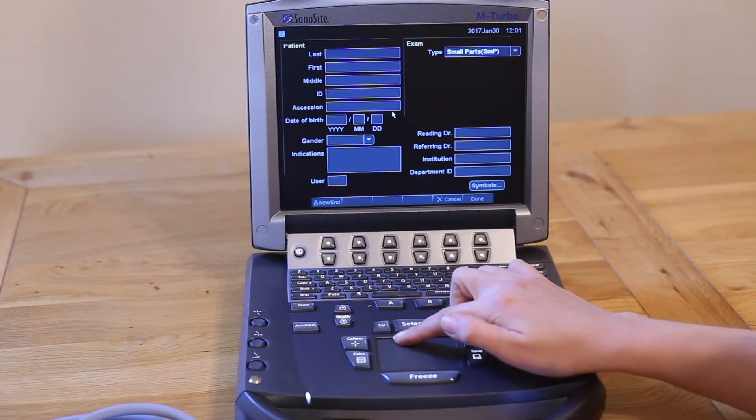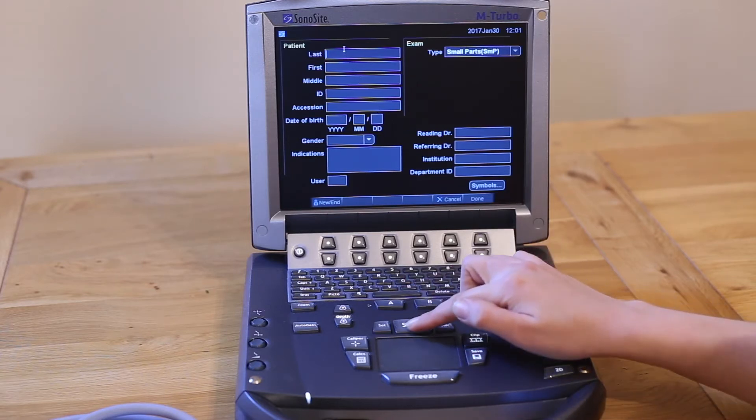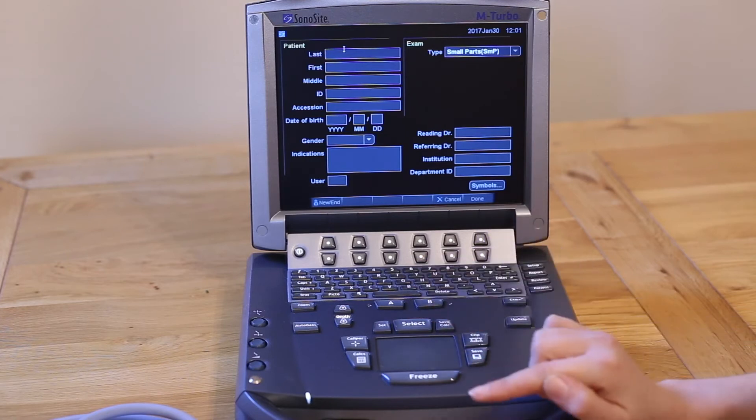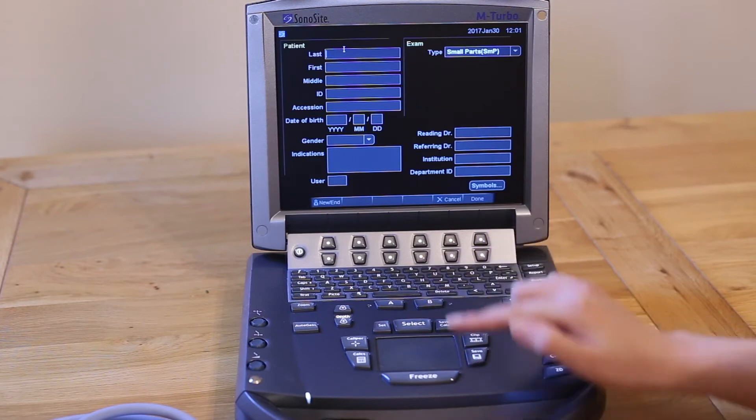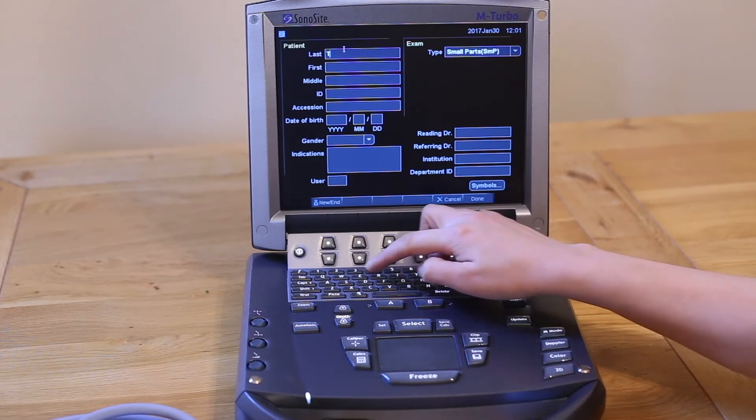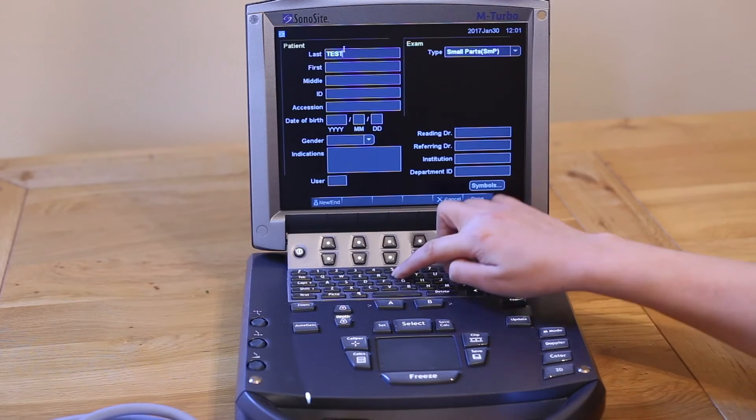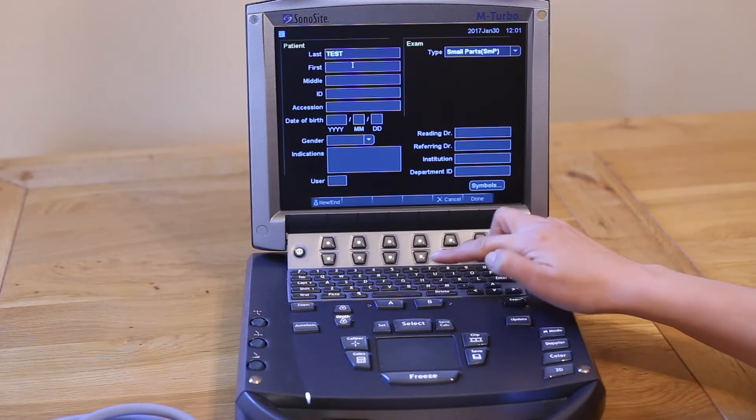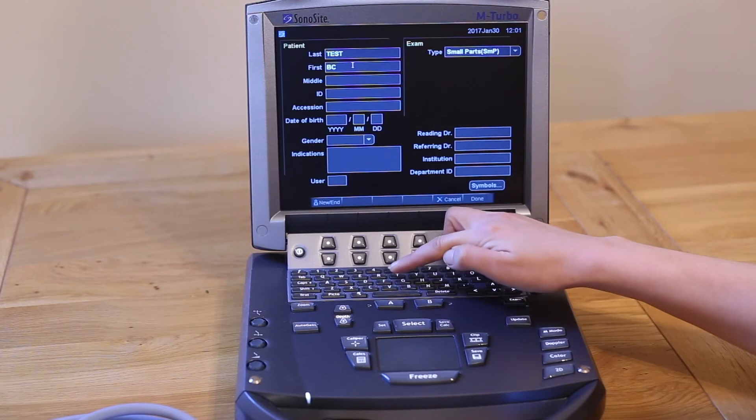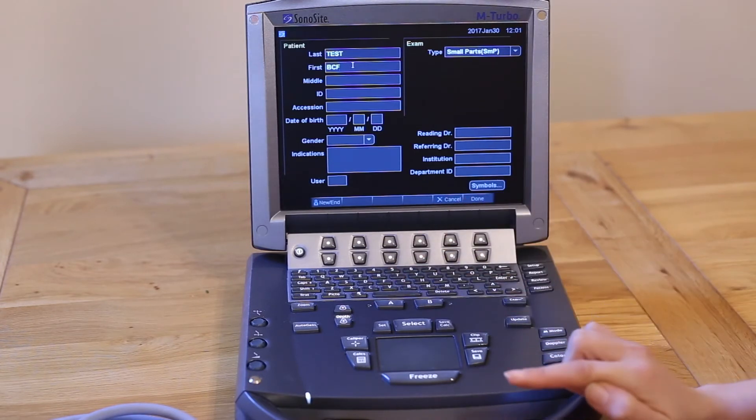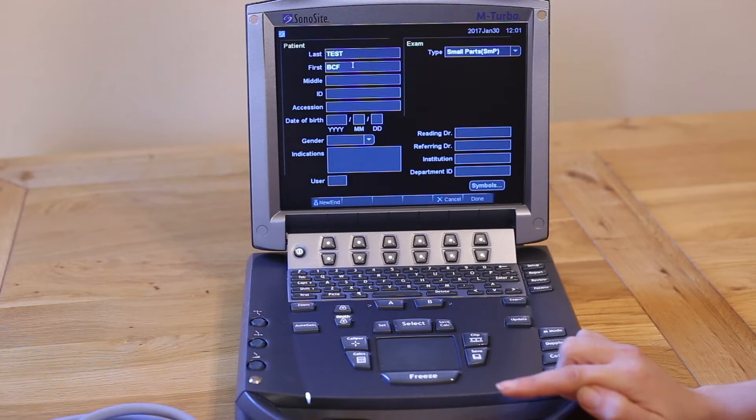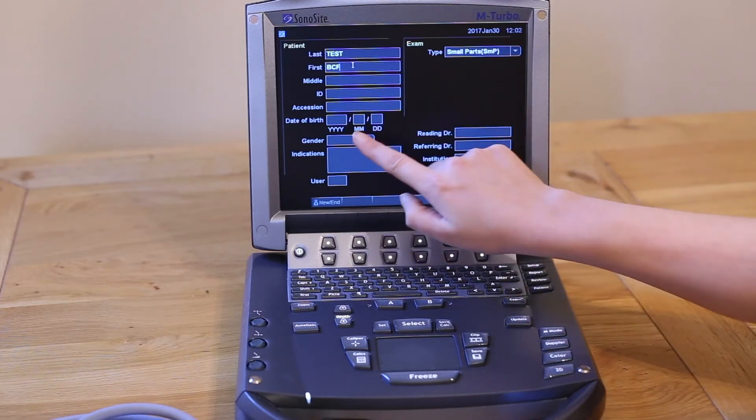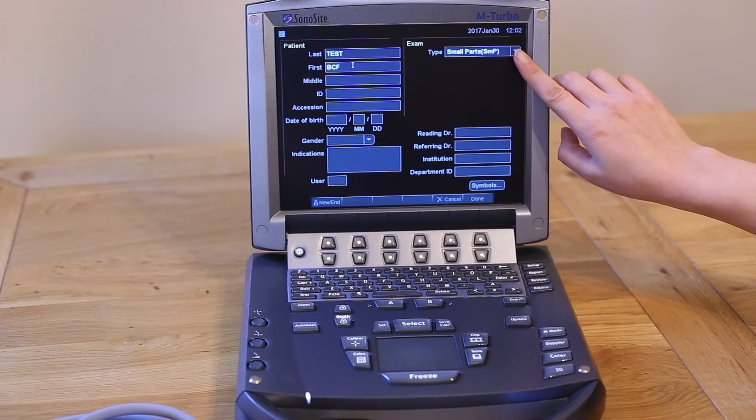Enter your details using the letters on the keyboard. You must enter a last name, usually the client surname, and a first name, usually the animal name. You can enter any other details such as ID number or date of birth if you wish, but these are not essential. You can select your preset at the top right hand corner of the screen here, or you can do that later.